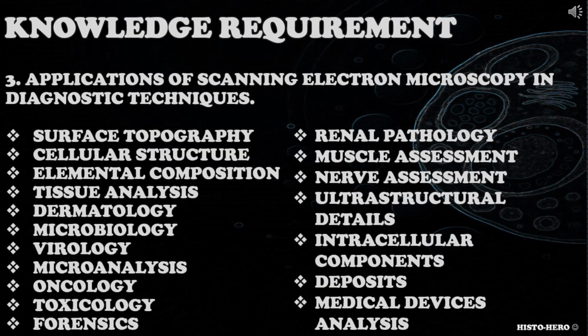When addressing this knowledge requirement, candidates should consider application of SEM as diagnostic technique, tissue analysis by visualizing ultrastructural details, intracellular components and deposits, surface topography analysis, assessing muscle, nerve and renal tissues, detecting infectious agents like viruses, oncology, and tumor assessment, especially poorly differentiated tumors.